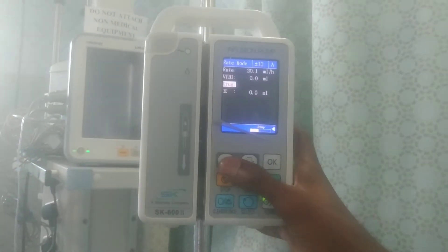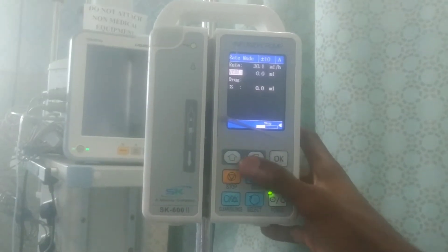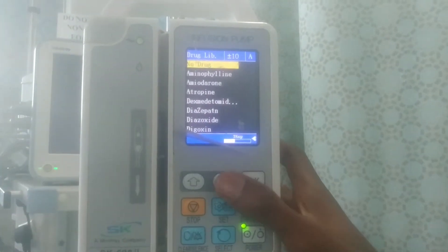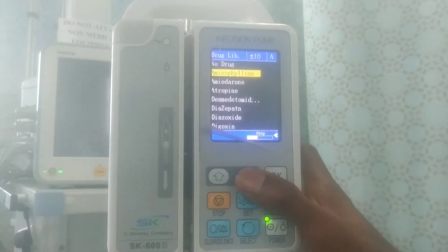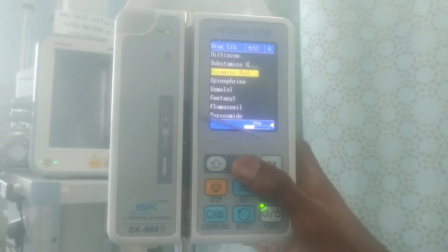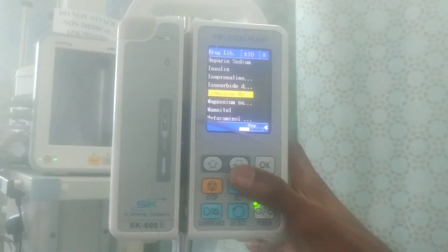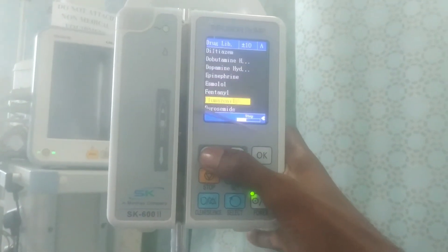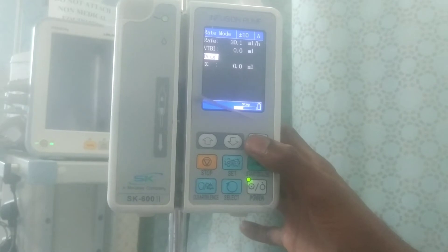You can also navigate down to set other parameters and click OK. You can take it down to the drug selection menu. These are the various drugs available — for example, atropine. You can select whichever drug you want to infuse the patient with. When you are done, click OK and continue.